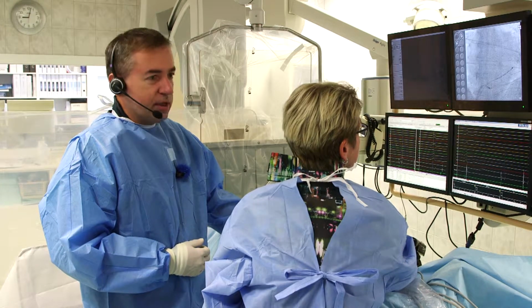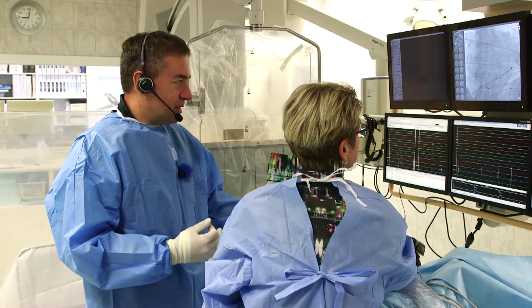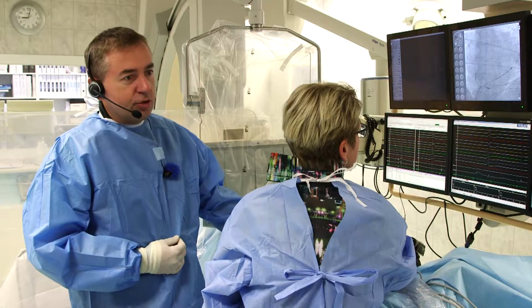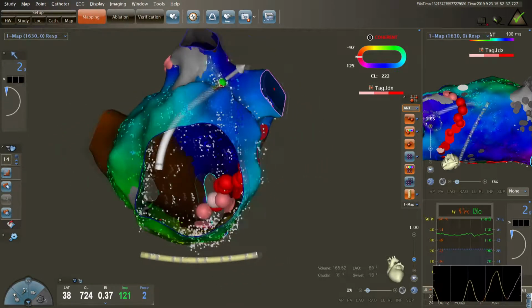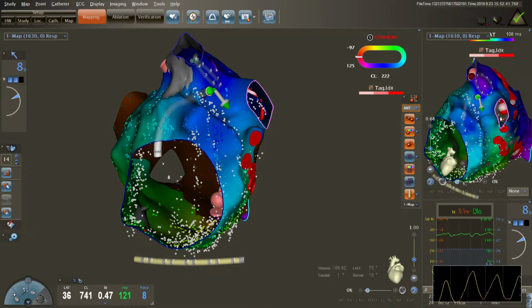First, in general, much more efficient data collection is possible with version 7, since this version enables us to create up to 60,000 points in up to 35 different maps. One map is limited with a maximum of 15,000 points, while in previous versions it was only 7,000 points.